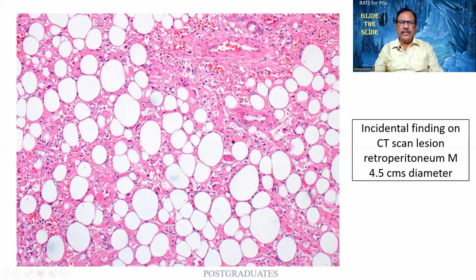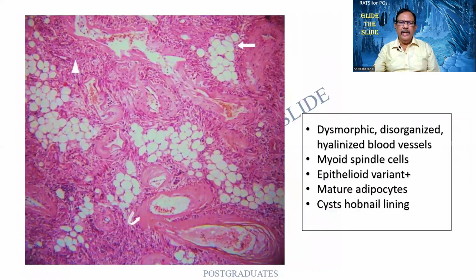Usually, when both are seen, we used to give a diagnosis of fibrolipoma. But then this third component is also over here. So the diagnosis can be angiomyolipoma. This is in fact a better slide. I am finding groups of these mature adipocytes which are getting entrapped in a dense connective tissue stroma, which is clearly revealing spindle-shaped cells. So the adipocytes and the myocytes are quite clear.